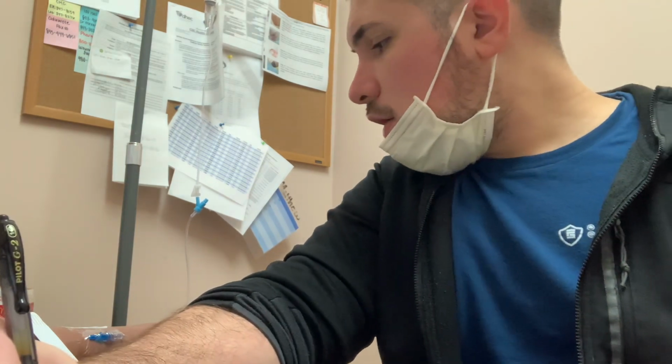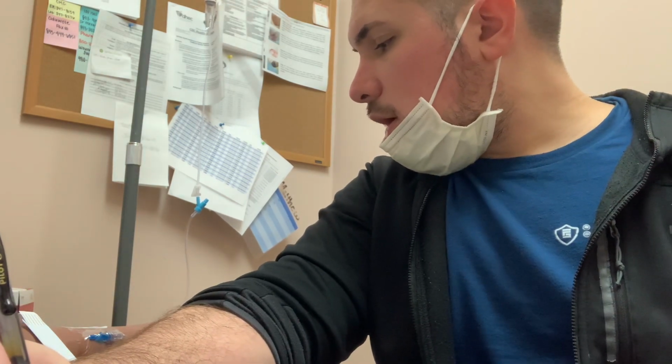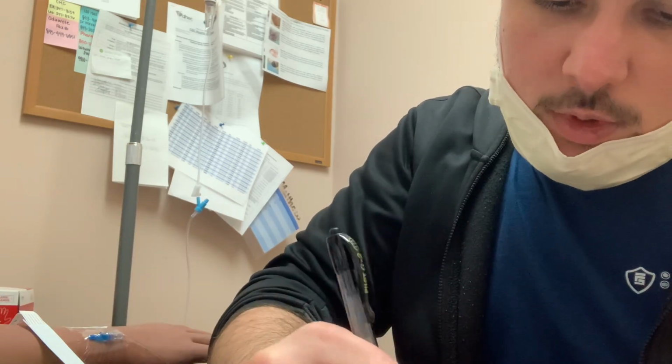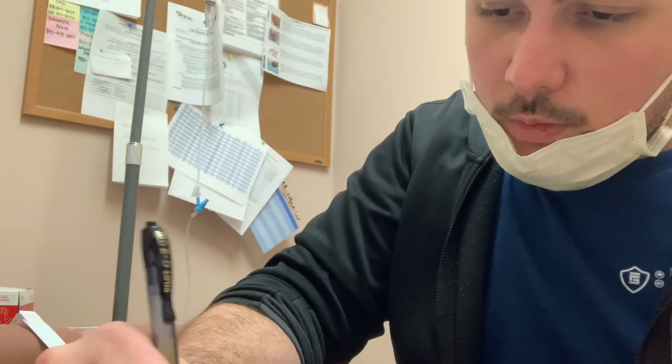Injection site, we have our right forearm, and we will sign it, and we will initial it.